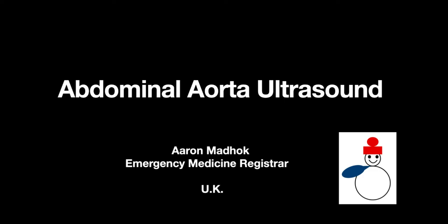My name's Aaron. I'm an emergency medicine registrar currently working in the UK. And if you're wondering what that snowman's doing there, well, you might already know, but if not, then it'll become a bit more apparent later on.